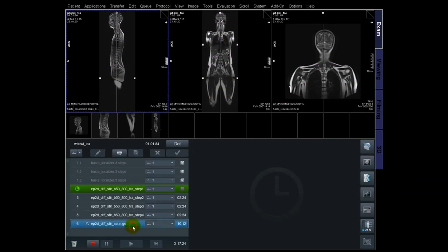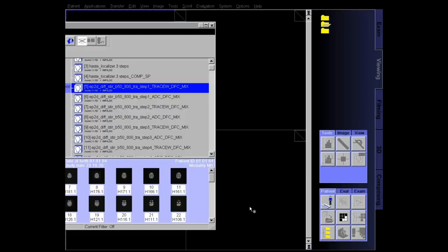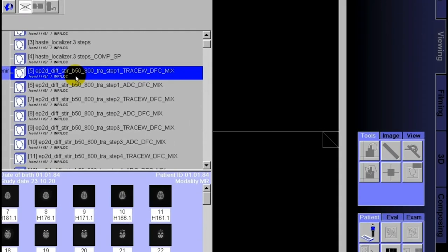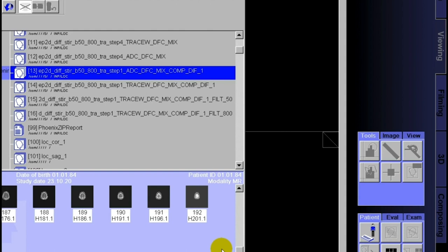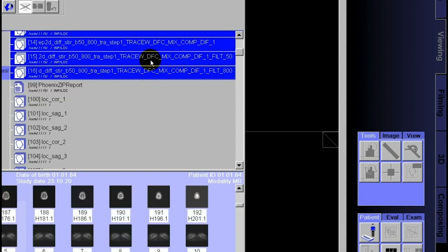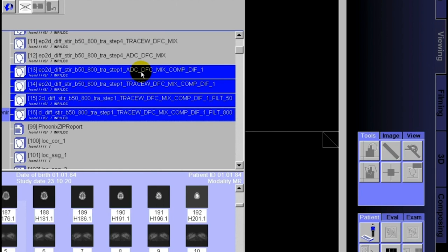While that is running, we're going to check the images and do the post processing. So here at the post processing — remember that diffusion trace images consist of multiple b-values. Here I have two b-values: b50 and b800, and then the ADC comes by itself. You can see step one, step two, step three, step four — and here are the composed images of the ADC, and all composed with a filter of b50 and a filter of b800.